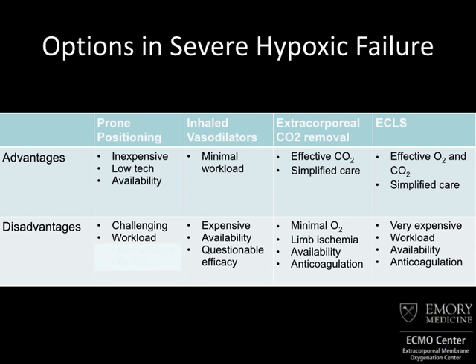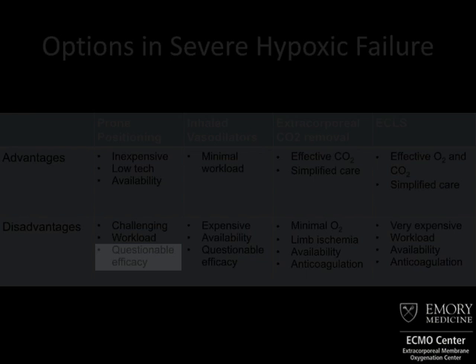And then there's this idea of extracorporeal CO2 removal, which is ECMO light. It will clear CO2, but it doesn't provide enough flow to provide oxygenation, and it has a number of limitations associated with it. And then there is ECMO, or what's sometimes referred to as extracorporeal life support, which provides full oxygenation and CO2 removal. It is very expensive, and it does have significant workload, but it does simplify care considerably.